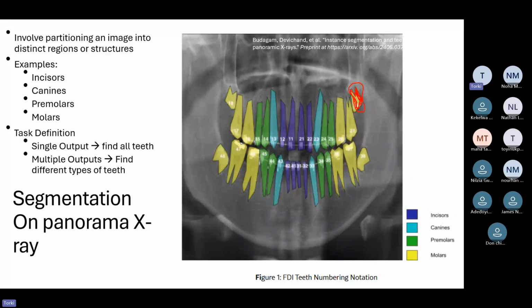Okay, so I compute the number of pixels in the overlapped area. I count them now. Every pixel that is overlapping will be counted. Okay, let me give another color. How to get another color? I don't remember.